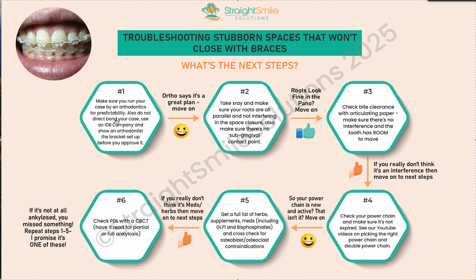So I actually have a lot of content on this. There's one called tapered. I think the keyword is tapered, and it's about tapered teeth that have subgingival contact points. Looks like there's a space. It's not really a space. It's just the shape of the teeth. So you got to make sure it actually is a space. That's why you take the x-rays. All right. Roots look fine in the progress panel.